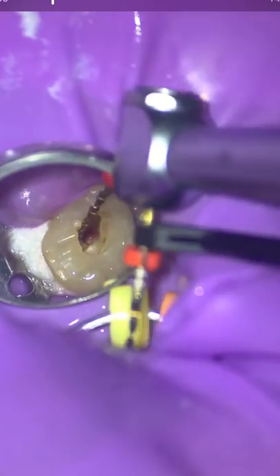I know that this is already going to length, and I'm not going to use a 10 file. I'm just using the straight rotary, reciprocating file. So I'm going to place my Apex locator right on the file, stop it, and take my measurement there. I normally don't do that, but in this case the canal was pretty wide open and it dropped right down. I feel pretty confident after something like 5,000 of these teeth that we're good to go with that.